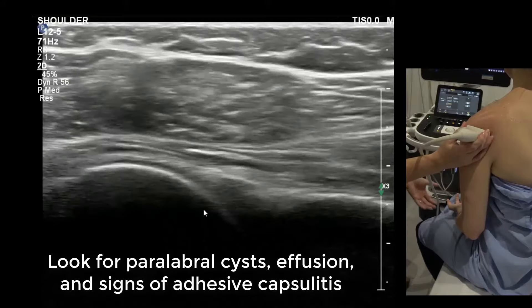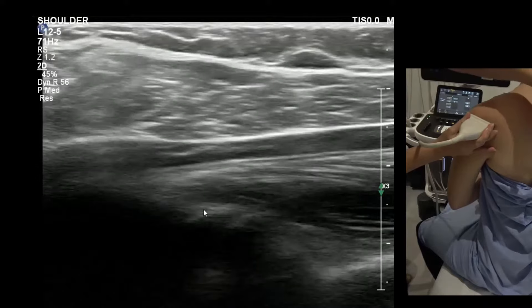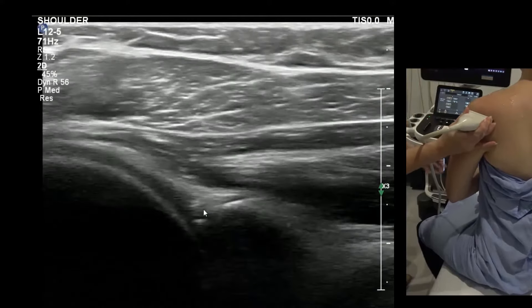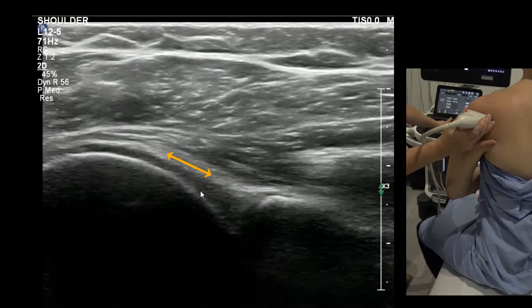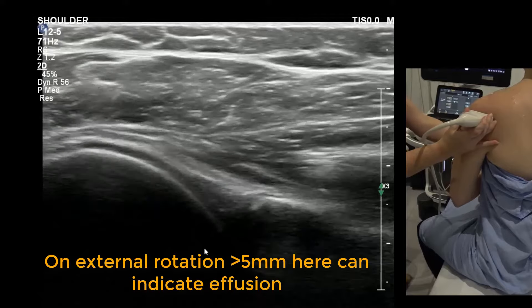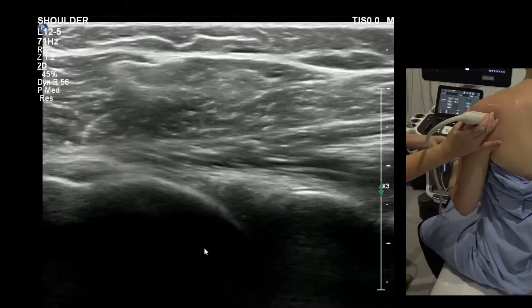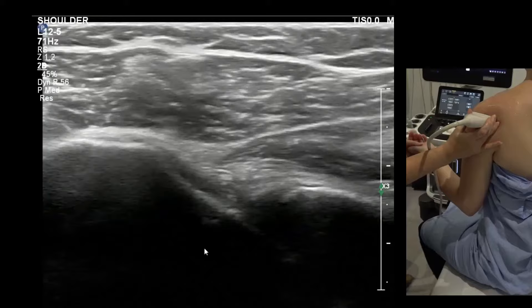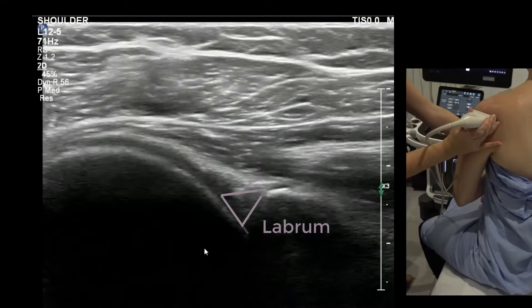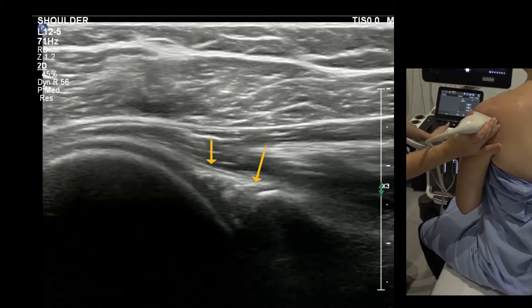For the posterior glenoid view: keep the palm up, tuck in under the chest, sit up straight, and encourage the patient to straighten the spine. We're watching the capsule slide over the labrum — this is scapula, this is humeral head. Watch the capsule on external rotation and internal rotation, guiding the patient through that movement. Make sure they touch their tummy each time — don't come out too far. It's the first part of external rotation that shows us that lovely gliding movement of the capsule, separate from the labrum.